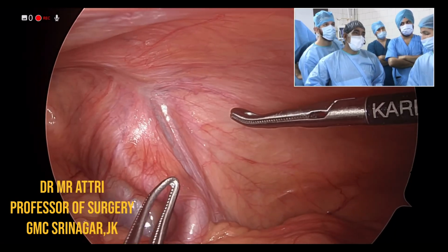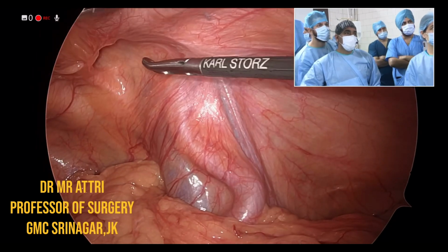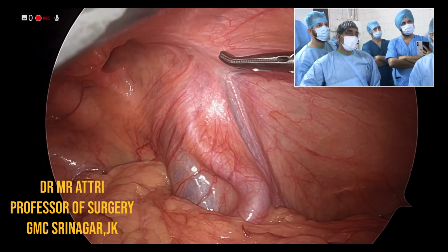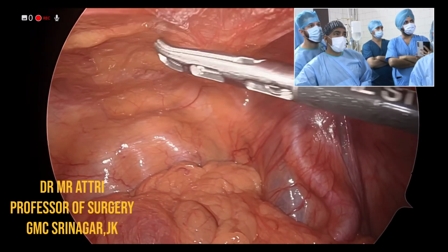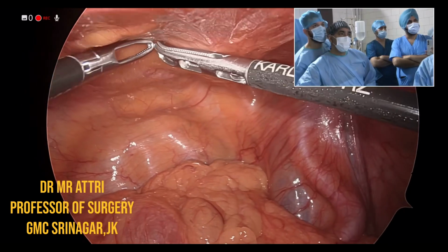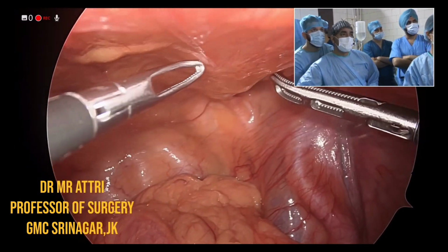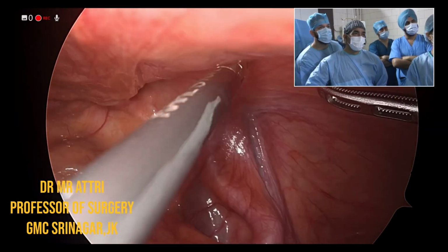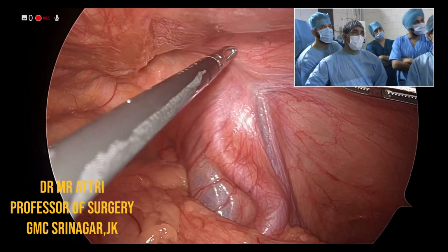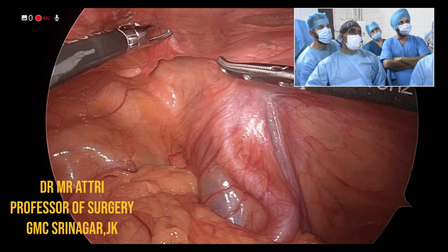Thank you so much. We'll be just revising our anatomy here. This looks to be a direct defect, and this is the midline. This is the median umbilical ligament, we presume a remnant of the urachus. This is the medial umbilical ligament, and we come here, this is the inferior epigastric vessel. So a hernia which is medial to the inferior epigastric vessel is a direct inguinal hernia.